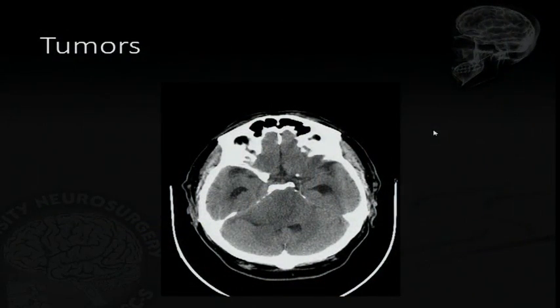And again, the tumors, which can give you stroke-like symptoms. If you just have a non-contrast CT, you would call this likely a meningioma. It could be a schwannoma. I mean, it's an extra-axial tumor. And then they can decide whether they're going to give TPA or not. If it's intra-axial, then it's a no-no, so they're not giving TPA. But if it's a meningioma, they may or may not give TPA.